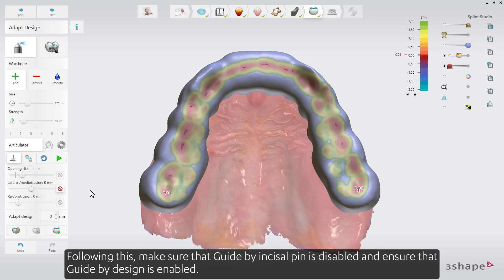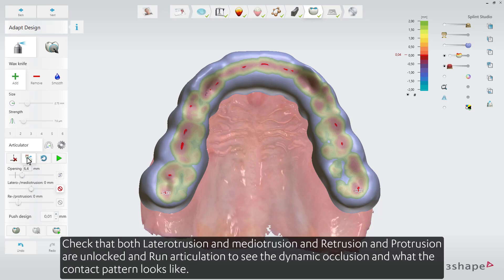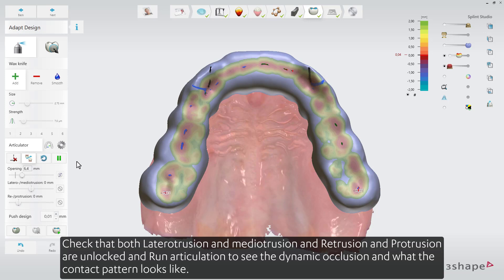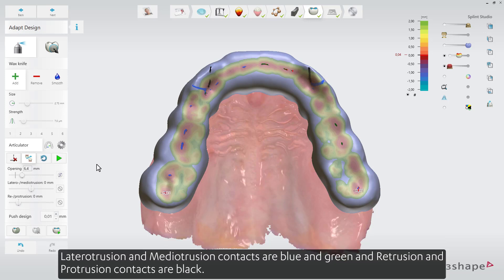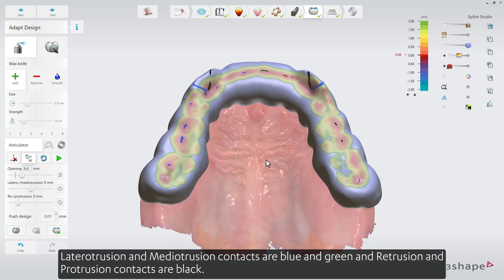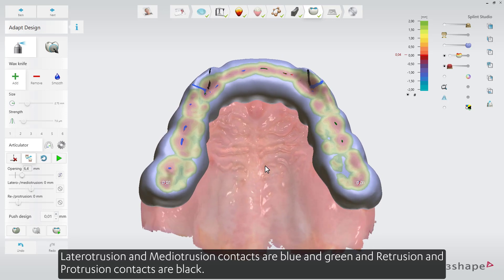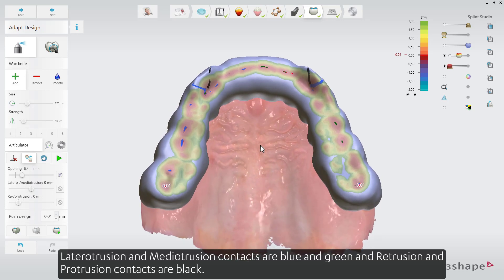Following this, make sure that guide by incisal pin is disabled and ensure that guide by design is enabled. Check that both laterotrusion and mediotrusion and retrusion and protrusion are unlocked, and run articulation to see the dynamic occlusion and what the contact patterns look like. Laterotrusion and mediotrusion contacts are blue and green, and retrusion and protrusion contacts are black.